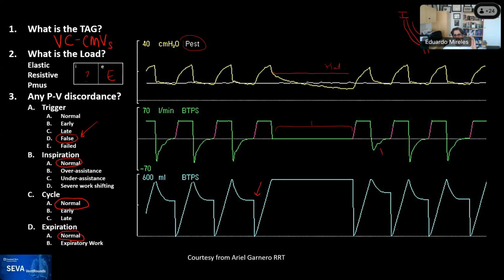Now it does it automatically in the majority of ventilators. In some, you can still modify that. And so if I'm putting out 5 liters, the expiratory is going to be receiving 5 liters. But if I make an effort and air goes in, then the expiratory is going to receive less, and then the breath is triggered.